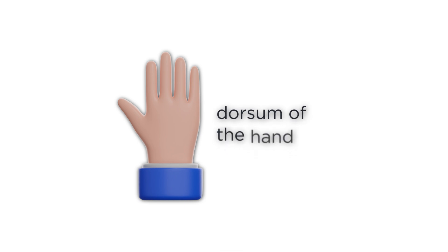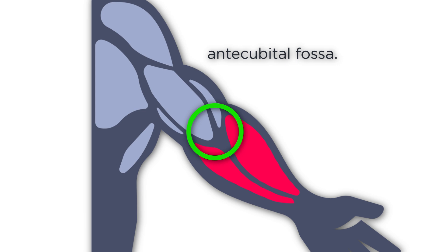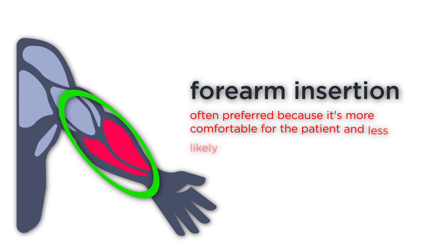The most common insertion sites include the dorsum of the hand, forearm veins, and the antecubital fossa. For this demonstration, I'll be showing you a forearm insertion, which is often preferred because it's more comfortable for the patient and less likely to become dislodged.